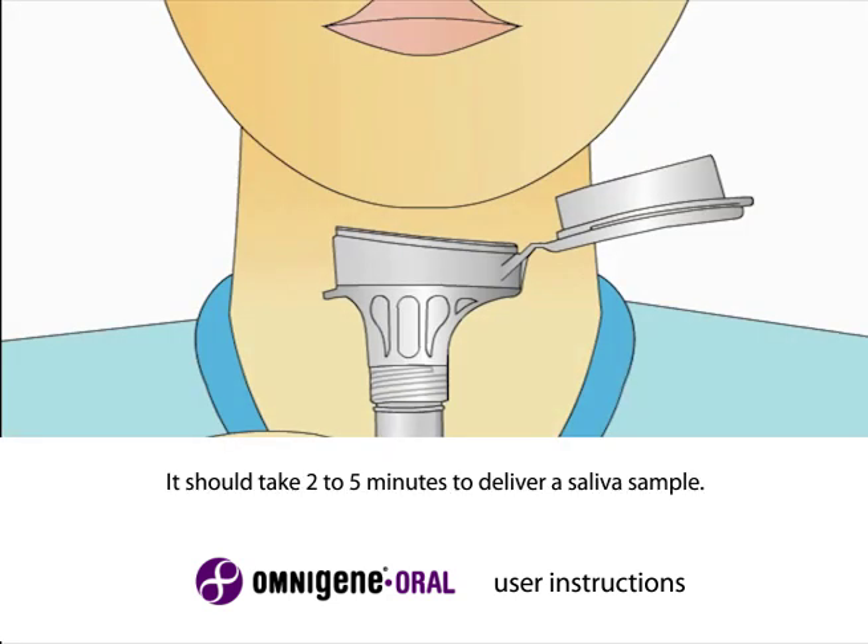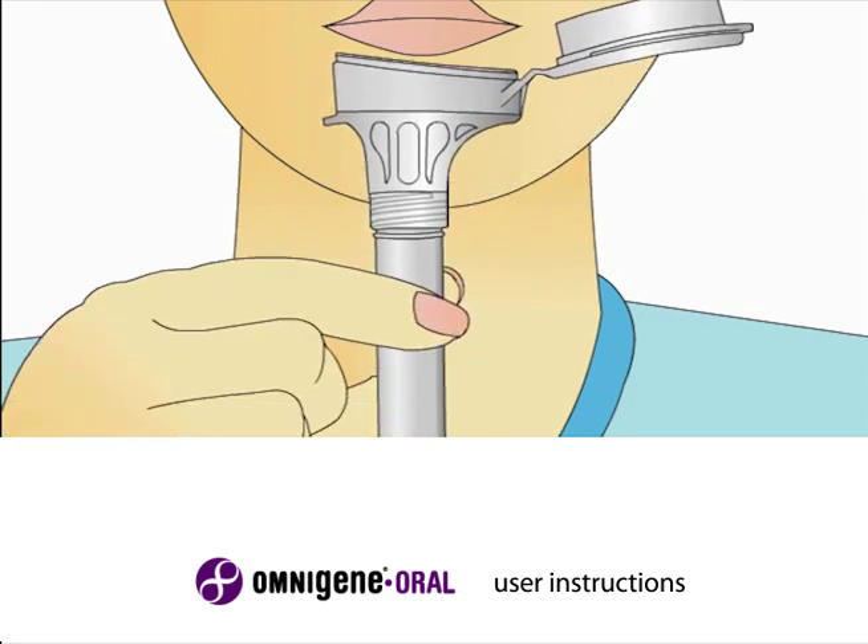Most people take between 2 and 5 minutes to deliver a saliva sample. Before spitting, relax and rub your cheeks gently for 30 seconds to create saliva. Place the top of the funnel close to your bottom lip and start delivering your saliva sample by spitting into the funnel.